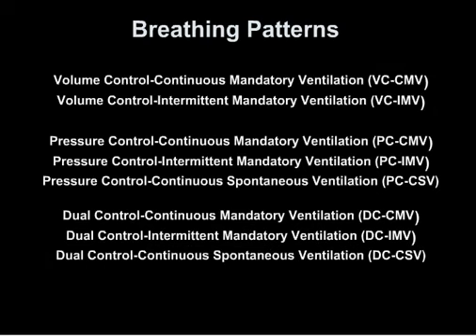Now, breathing patterns. There are 8 distinct breathing patterns. There is volume control CMV. There's volume control IMV. There's pressure control CMV, pressure control IMV, and pressure control CSV. Additionally, there's also dual control CMV, dual control IMV, and dual control CSV.